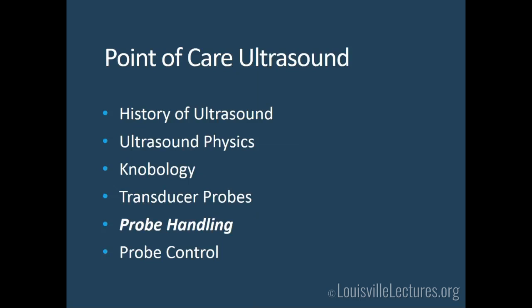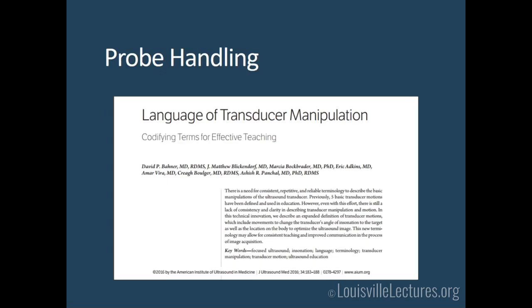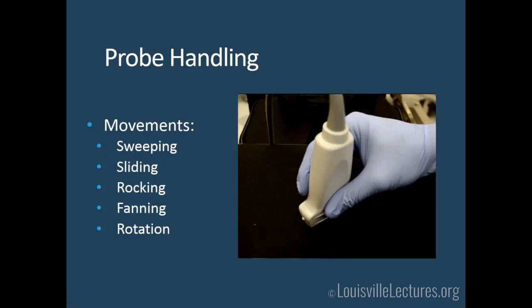Probe handling is important. When I'm teaching ultrasound, I fail if I have to take the probe away from you. If I can communicate using nomenclature and tell you what movements to make without grabbing the probe, you'll learn better when scanning live. There are five main movements with a probe, based on the X or Y axis.